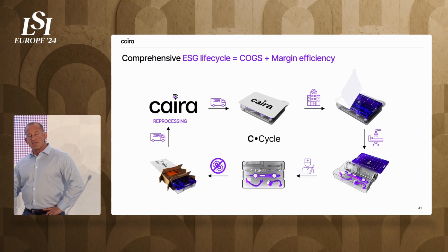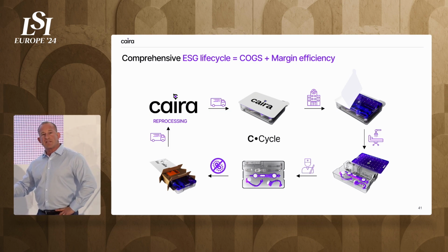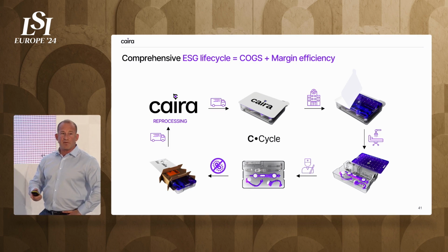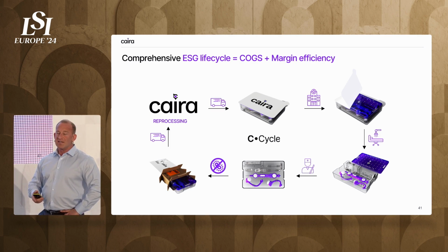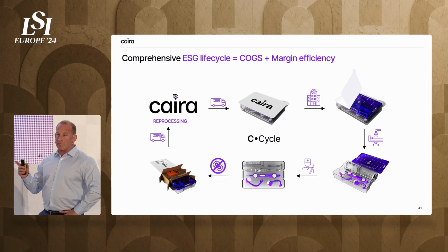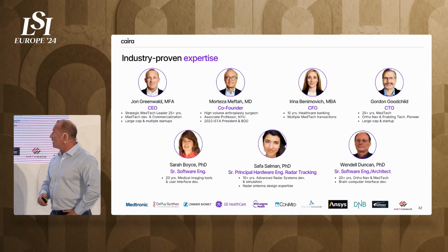So the electronics inside the beacons remain sterile throughout the procedure. So it's a matter of opening those beacons, taking out the electronics and reprocessing, putting them through a QA cycle and back into the manufacturing cycle. The objective here is to reduce our COGS. If we can get 10 turns out of a beacon, we've reduced our COGS dramatically. This helps us overcome another barrier and push the cost envelope to get technology into more frequent use.